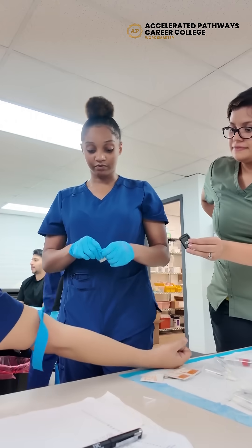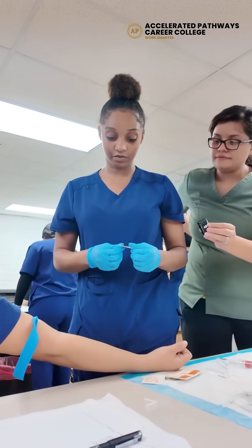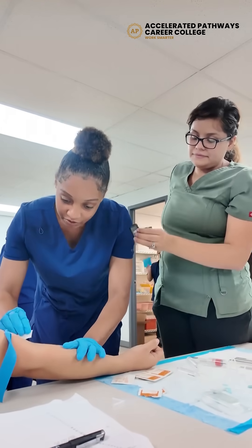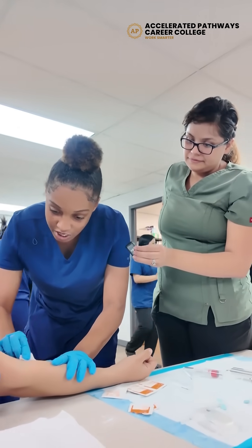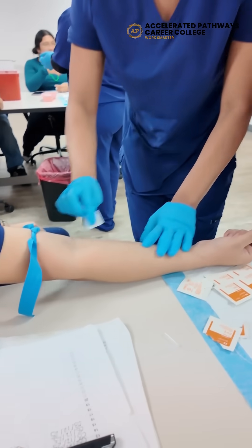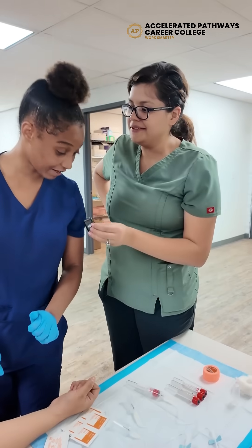Okay, then I found the vein, so now I will be wiping it down with alcohol, and I will be doing it in a circular motion. Why can't you just do it like that? Because it's spreading bacteria.